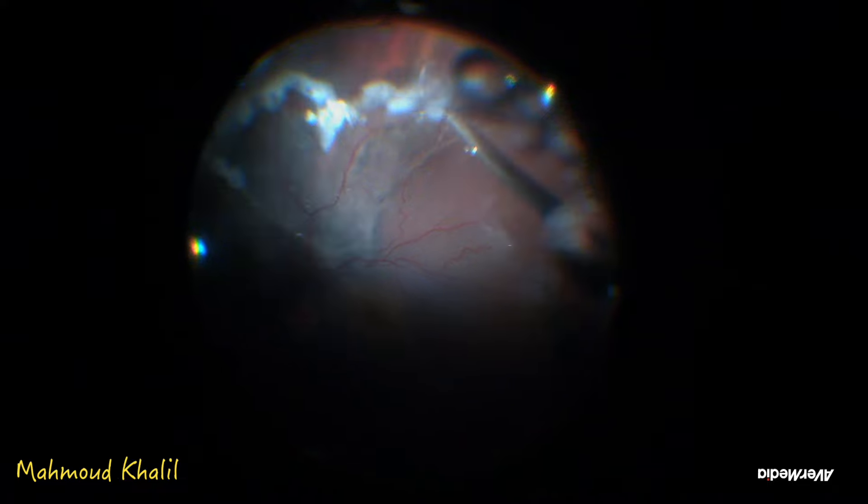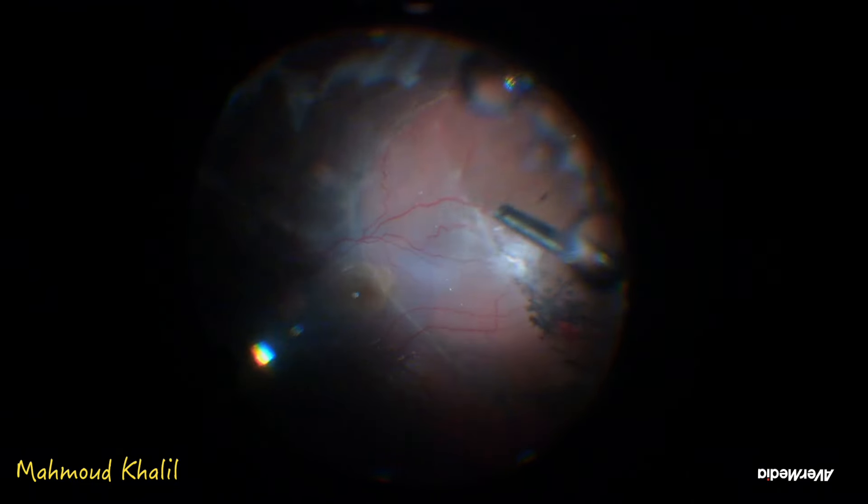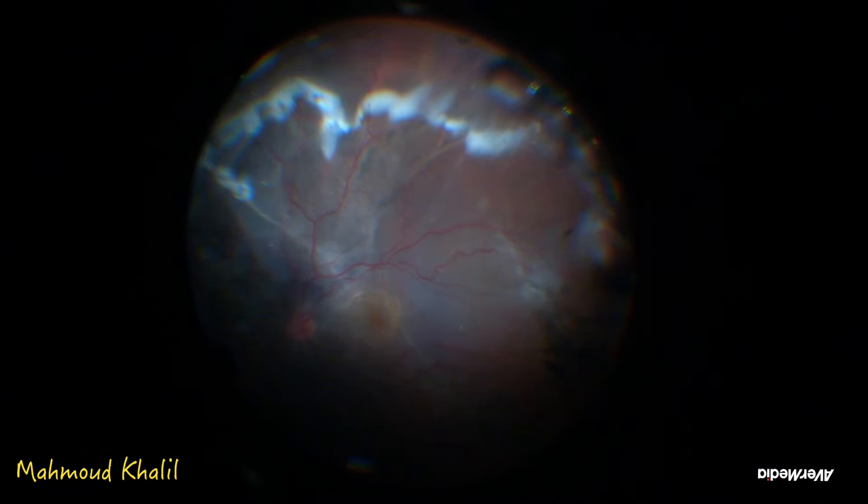Then the retinotomy is fashioned. The site of retinotomy is chosen according to the site of endo-PVD induction — at the farthest point of PVD induction, the retinotomy was fashioned. This ensures the edge of the retinotomy is free from any traction and any vitreous overlying it, which helps prevent PVR and protect this edge from redetachment.